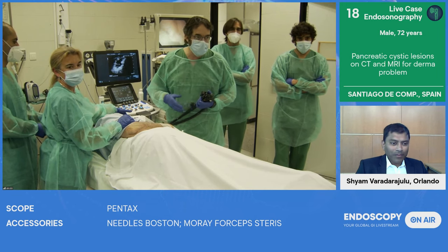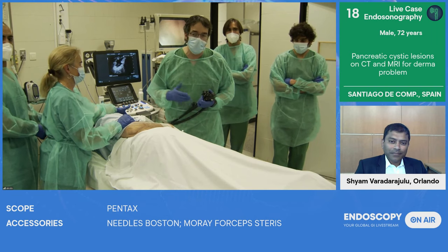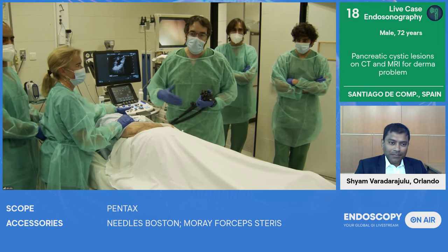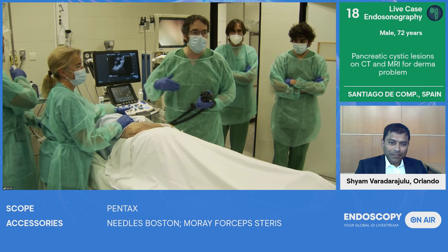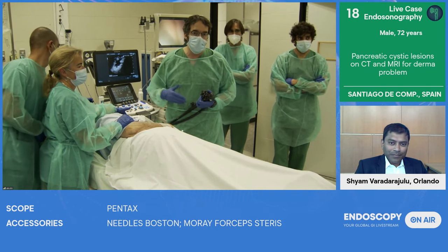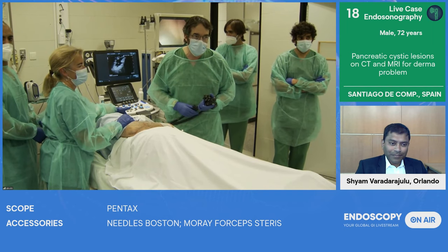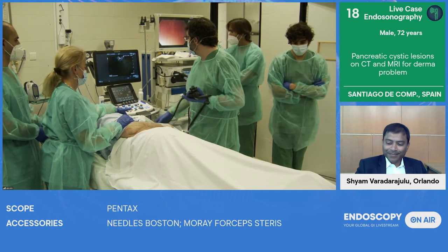So the goal of the case today is to try to optimize the differential diagnosis of these lesions. We have an idea because we've just been checking the case, but we want to share with you how we can approach and manage this type of case and how we can increase the diagnostic capabilities. Not only for the diagnosis, but how by EUS and EUS tissue acquisition, we can try to optimize the management of these patients. Awesome. So I think we can switch to the endoscopy image.